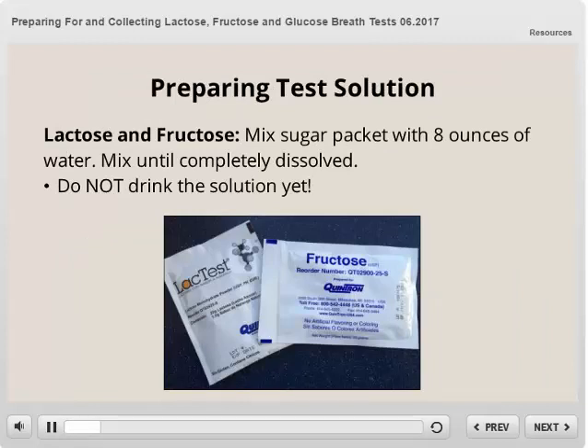On the day of your test, you will prepare the test sugar solution. For the lactose and fructose tests, you will mix the entire contents of the sugar packet with eight ounces of water. Mix until the sugar has completely dissolved. Do not drink the solution yet — you will collect one breath sample prior to drinking the solution.